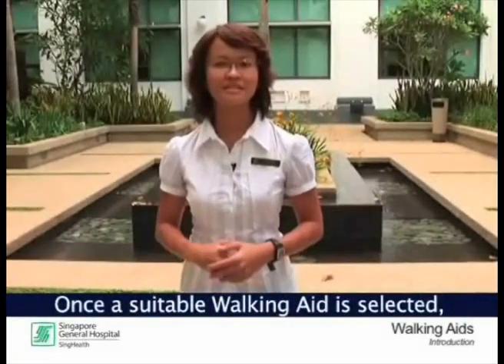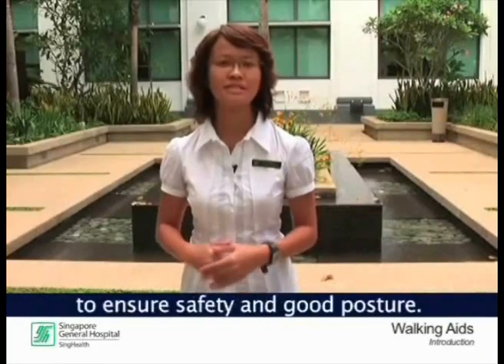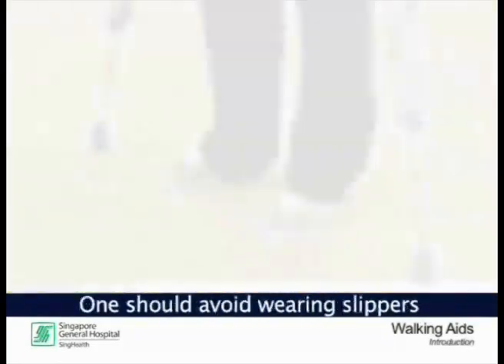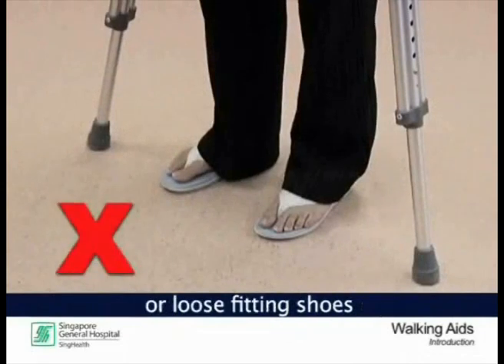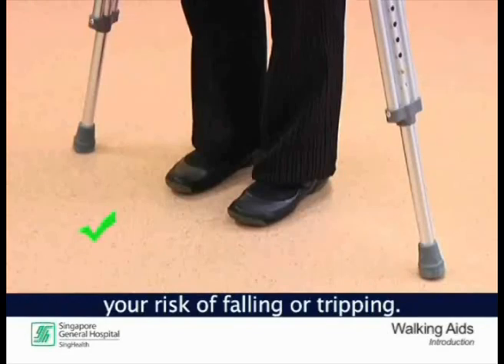Once a suitable walking aid is selected, correct adjustment and footwear is important to ensure safety and good posture. One should avoid wearing slippers or loose-fitting shoes when using a walking aid, as it may increase your risk of falling or tripping.